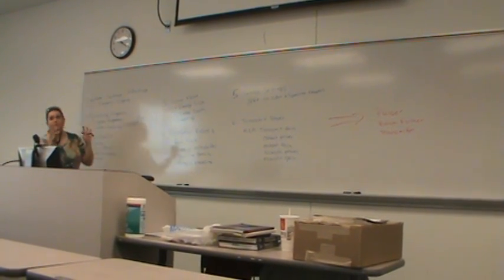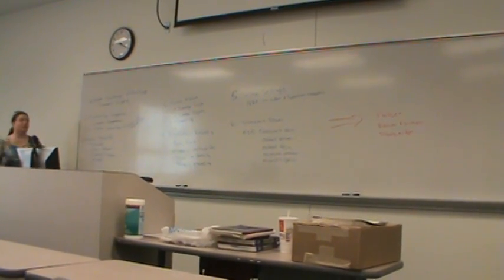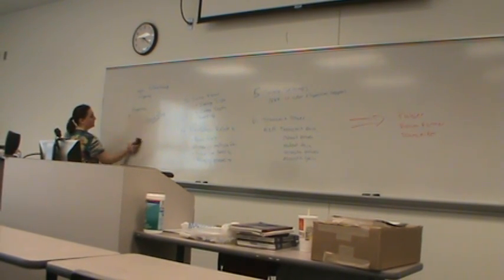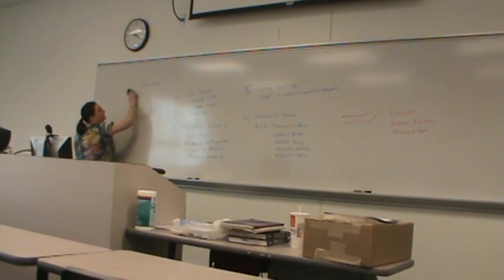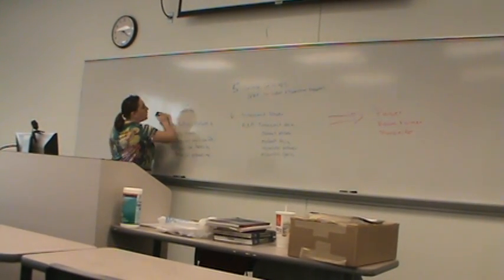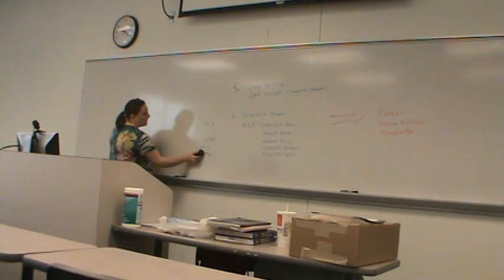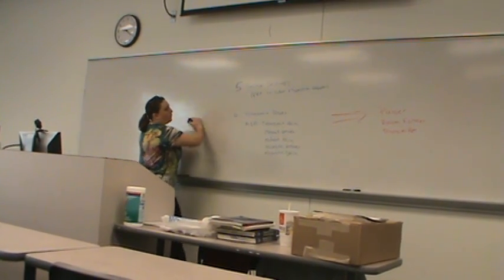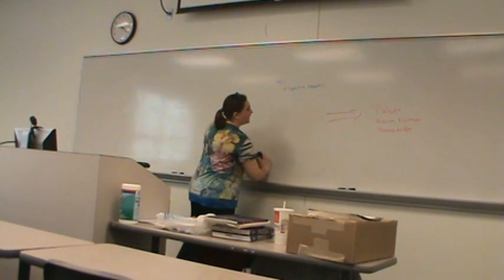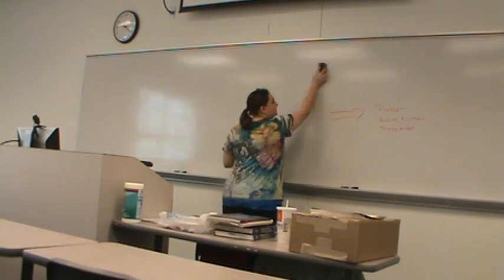All right, you got all this stuff? Because it's all in the way now. I need about 14 bazillion boards to be able to do this. Okay, so once we've made all of our choices and turned all those knobs and figured out what exam we're doing and what information I need to send, we send it from that beamformer and it goes to the transducer.